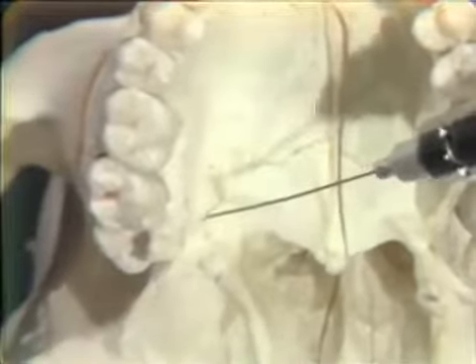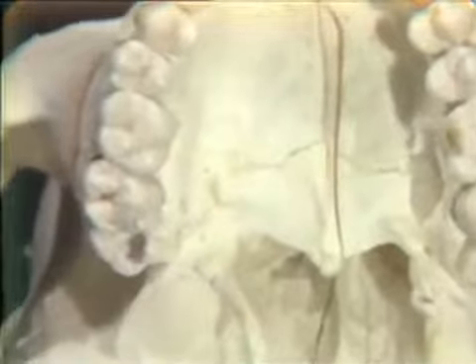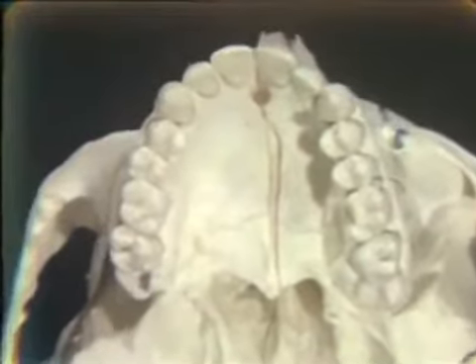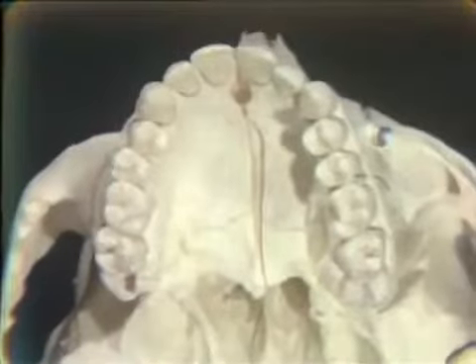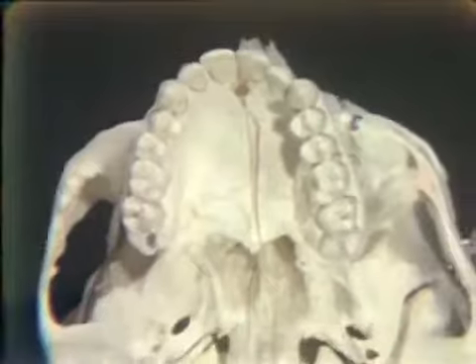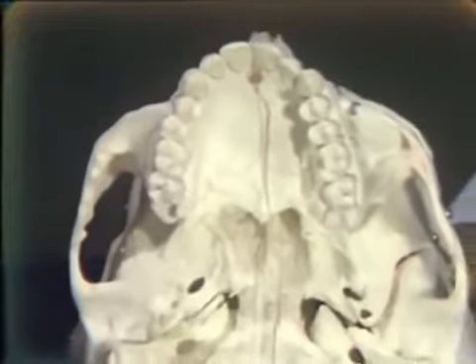Now this will anesthetize, as we said before, all of these palatal soft tissues from third molar to cuspid, which would be advantageous, for instance, if you're going to remove a quadrant of teeth and manipulate all of these palatal soft tissues from third molar to cuspid.